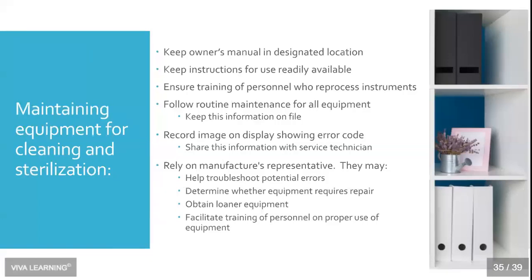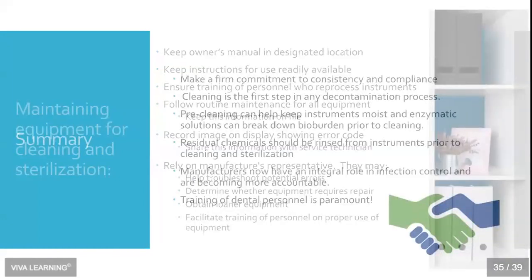There was a time where I had a new dental assistant in my facility, and the equipment that we had was different than what she was accustomed to using. So I brought in my manufacturer's technician and we had a lunch and learn session, and I asked him to share with us everything we needed to know about the water type, how to fill it, how to drain it, how to clean the filters, how to load it, how to ensure it was working correctly, everything we needed to know. So rely on those manufacturers' representatives. They are a wealth of information.